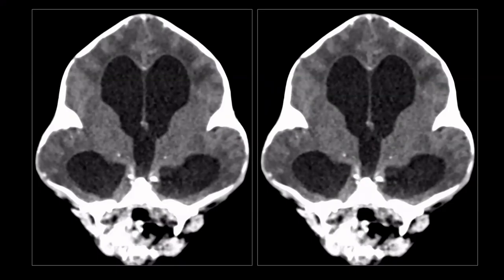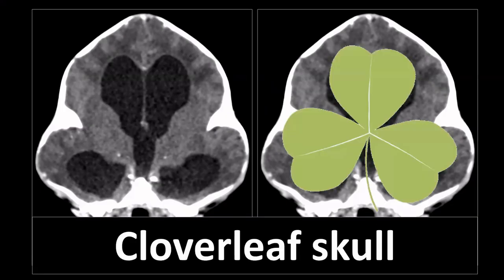This patient has craniosynostosis — a condition in which sutures have prematurely closed, leading to an abnormal skull morphology. In this case, the skull looks like a clover leaf, which is why we call this the cloverleaf skull. Practically all sutures have fused in this child.